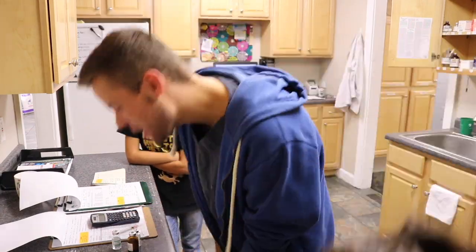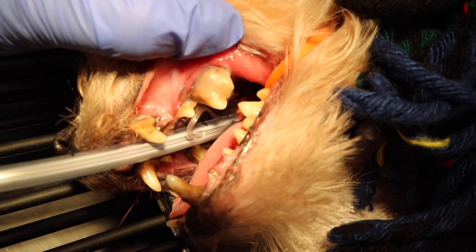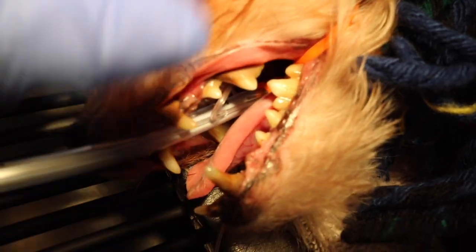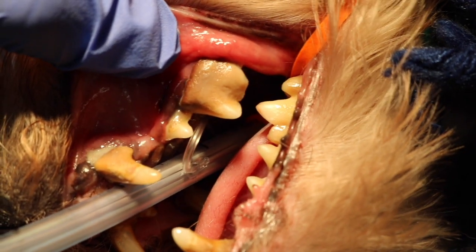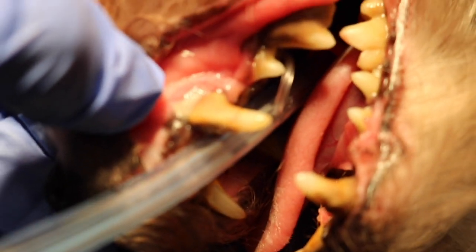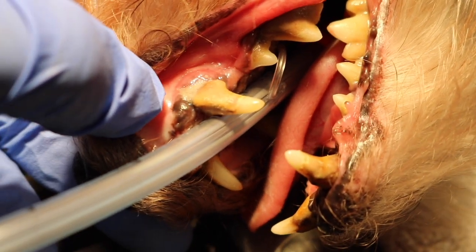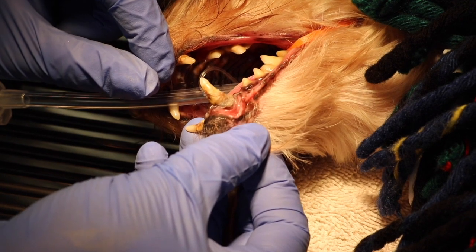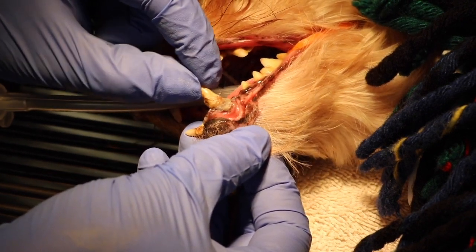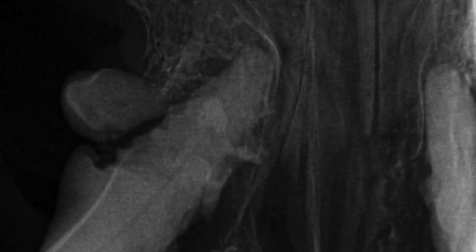Okay guys, so we're going to go ahead and jump in and get started. So for those of you that do not know, I am specializing in dentistry, and this guy came to me Monday morning. Look how terrible his gingivitis is — his teeth are infected. That is pus underneath his gums. He came to get his dental cleaning, but all of his teeth were mobile and they couldn't be saved because there was too much bone loss around these teeth.